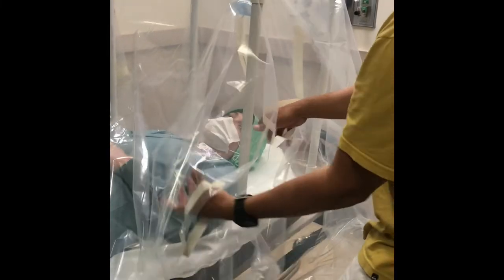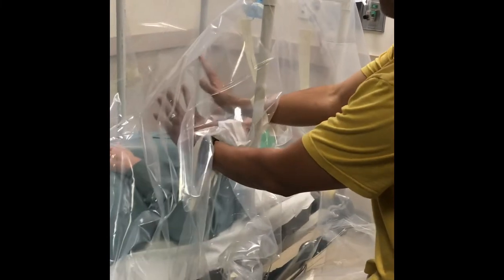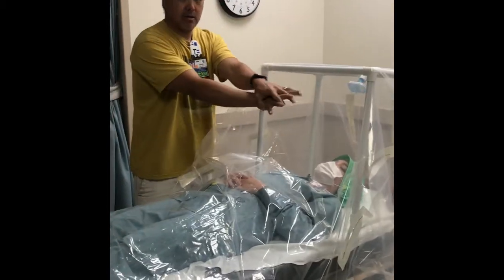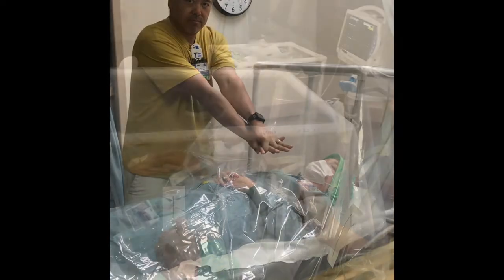There are also ports on both the left and right side of the patient for respiratory therapy to assist. It is at this stage that pre-oxygenation can be performed. If CPR is necessary, the enclosure is narrow enough to have access to the breastbone for compressions.